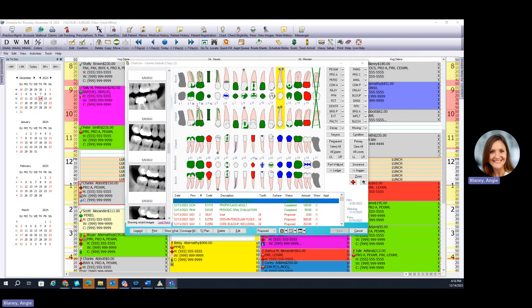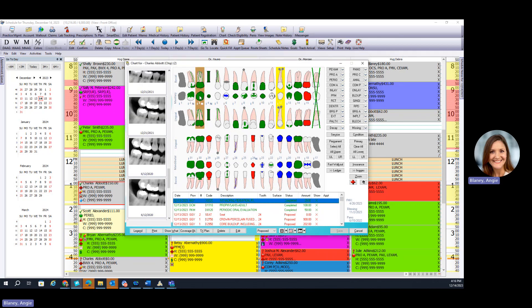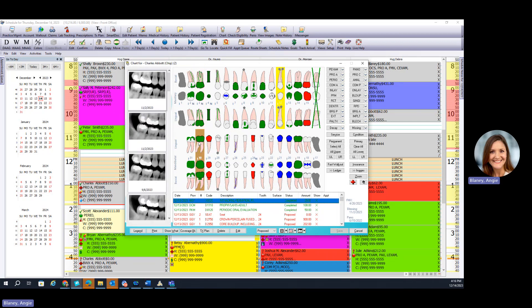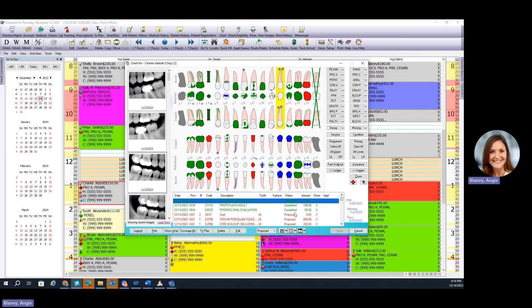Depending on which tooth you'd like to see, you can click on a particular tooth, and then it would narrow down those images on the left to those that contain that particular tooth number or teeth numbers. To take new images, you'd simply go into the lower right-hand side here on the chart and click into the x-ray module.